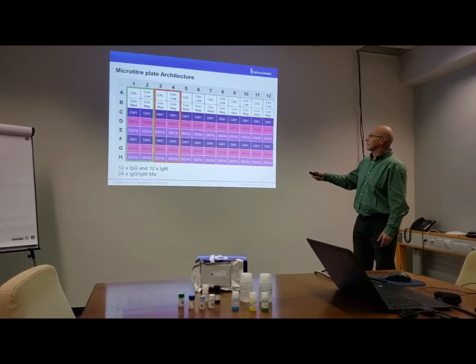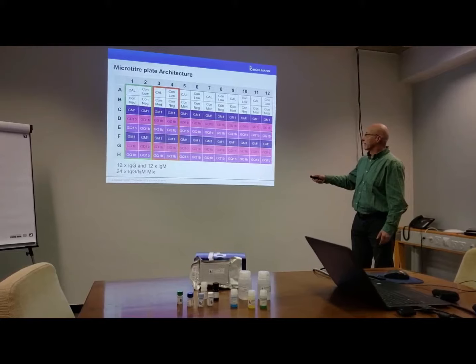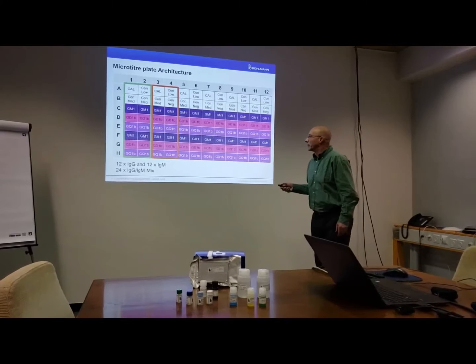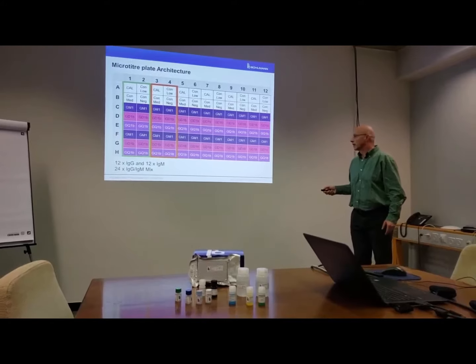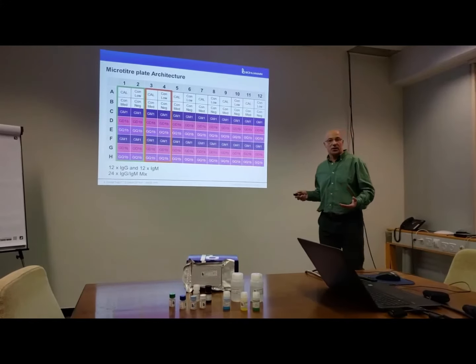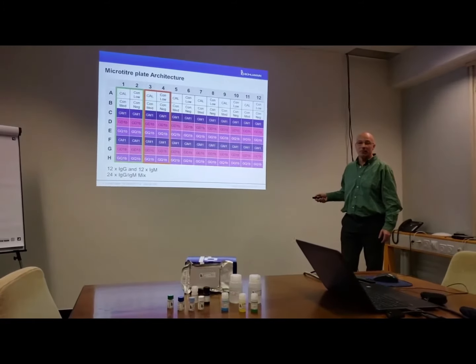Then next to the IgG, there are the same ganglioside antibodies again, but with IgM, which are related to chronic neuropathies. Now with one GanglioCombi Light plate, you may run as many as 12 IgG and 12 IgM, or if IgG and IgM are not relevant for your work, you may run an IgG-IgM mix instead.